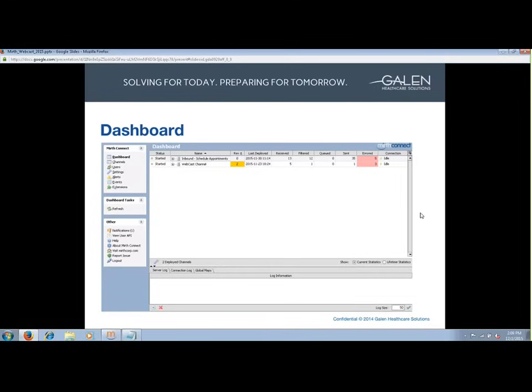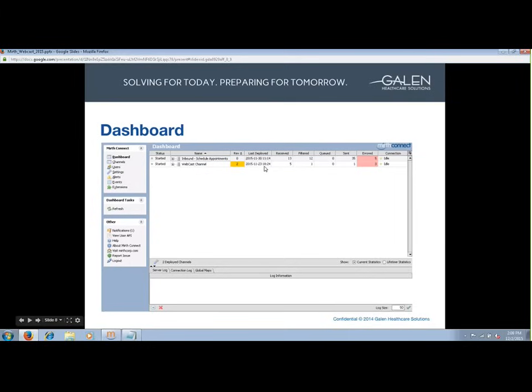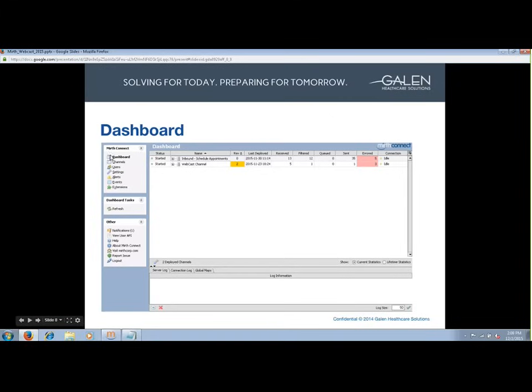Pictured here is the MIRTH dashboard, which shows deployed channels and tracks their deployment status. The term 'deployed' means a channel or interface that is live and ready to receive, send, or perform some type of operation. If you were to undeploy a channel, it more or less means inactivating it. Within the dashboard, we are also able to view connection status as well as message statistics such as how many messages were received, filtered, queued, sent, or errored. The MIRTH Connect panel in the upper left serves as a home base when navigating through MIRTH.